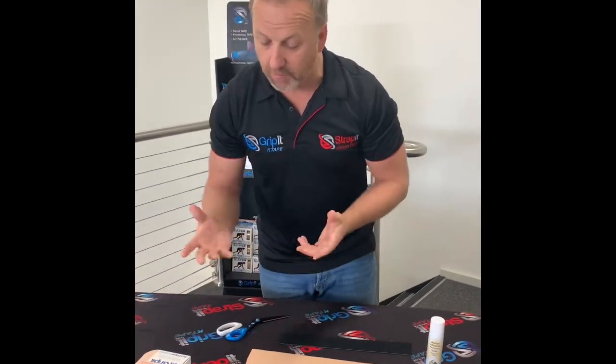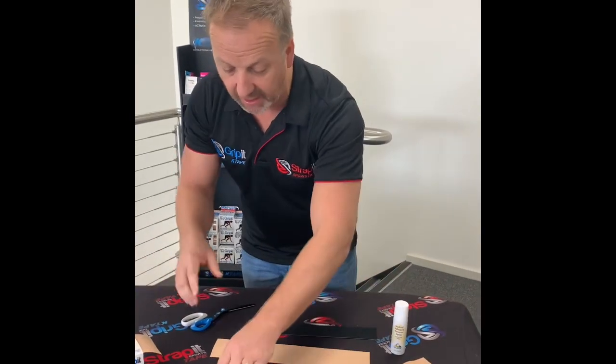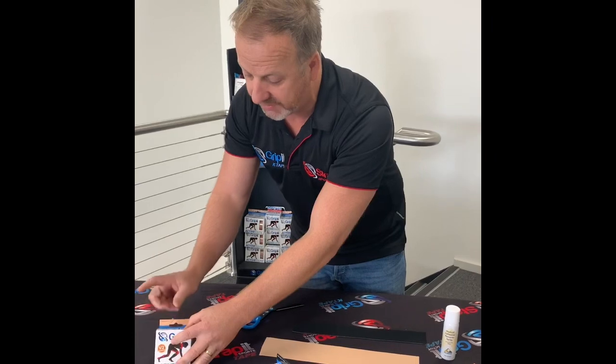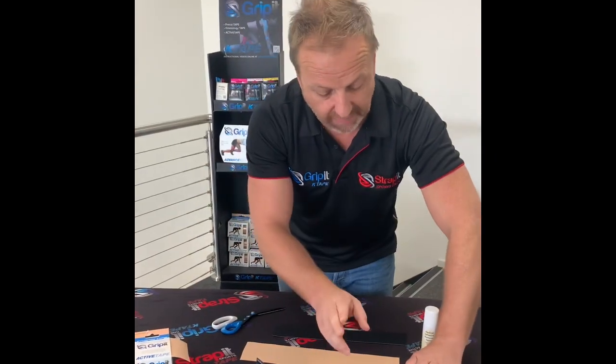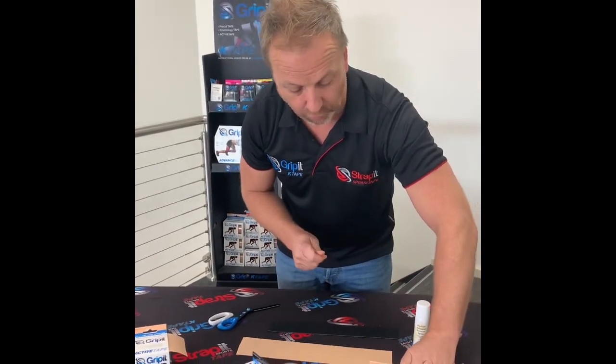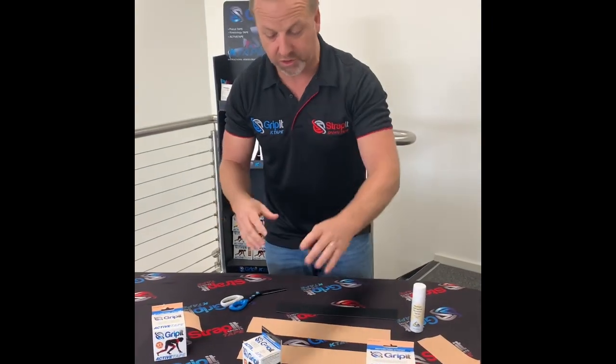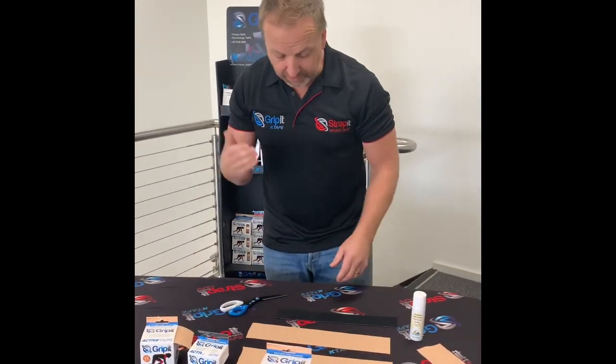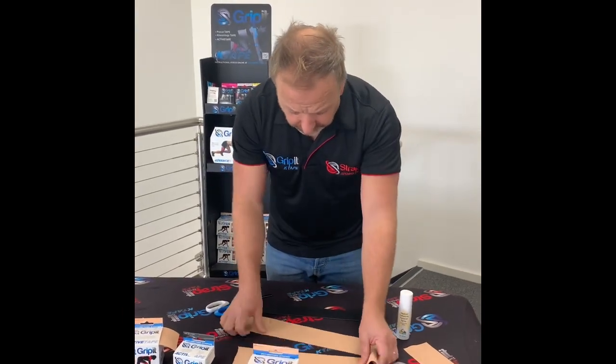First of all, just a reminder, we have 3 sizes. We have our 5 centimeter, our 2 inch, we have a 3 inch or a 7.5 centimeter, and we also have the big one, the 10 centimeter or 4 inch. So there's 3 size options in the V2 category. Okay, so application principles. Now, let's have a look here.